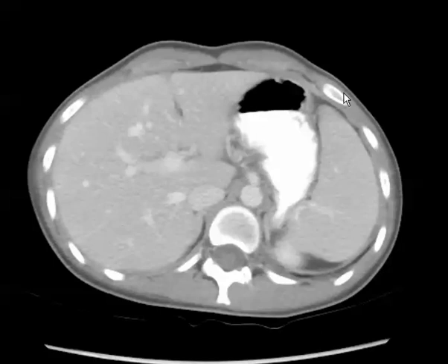These are axial CT images through the level of the abdomen and pelvis after the use of intravenous and oral contrast in a 21-year-old female with right lower quadrant pain.